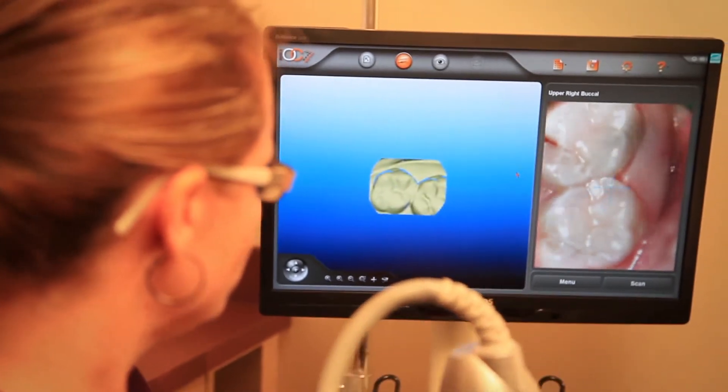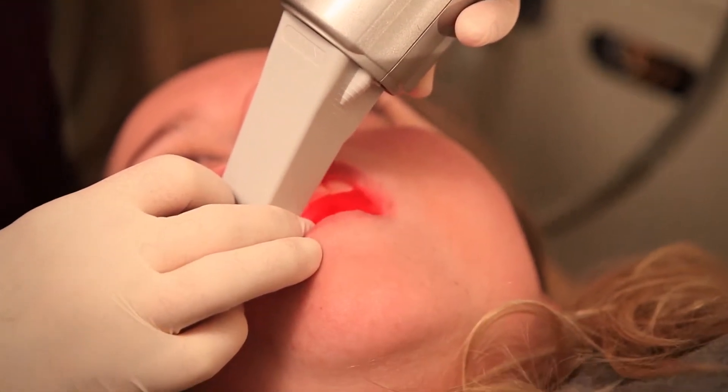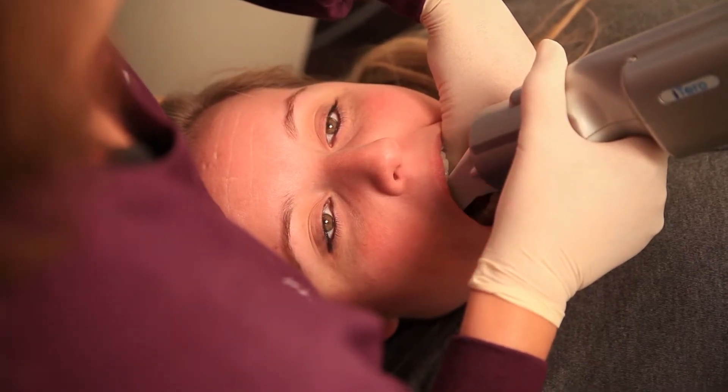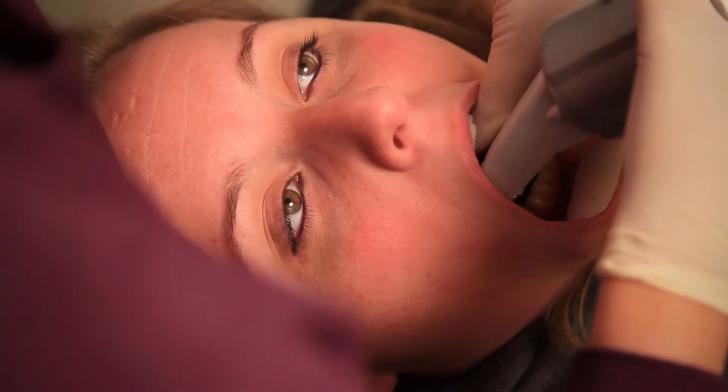The iTero scanner really has a lot of uses in the office. We use it for any patient we need to do a study on to make their study models, and we also use it for the Invisalign patients so that they do not have to go through the impression process. With the traditional impression process, we also have to mail the actual impression to Invisalign, which takes a few days in the mail.